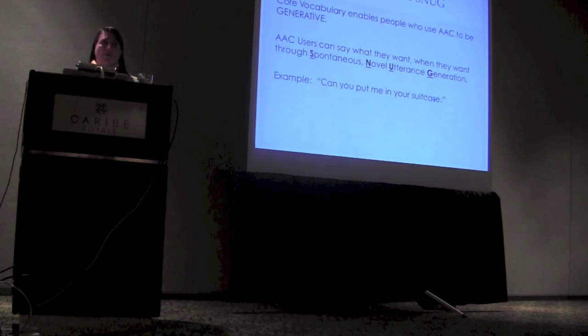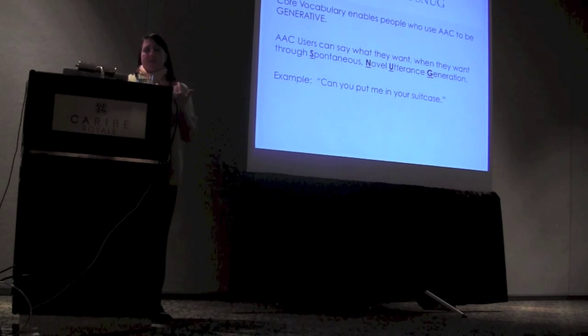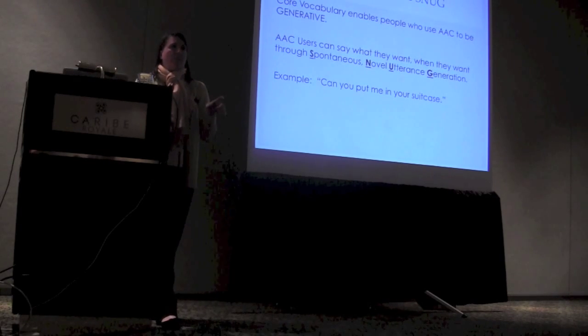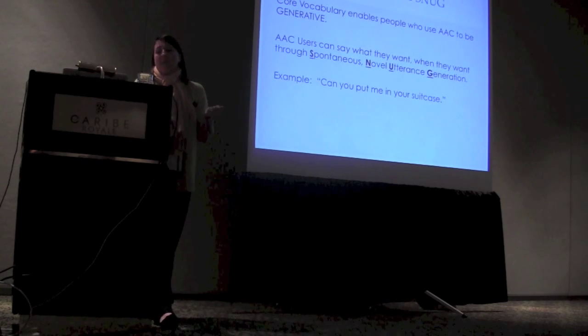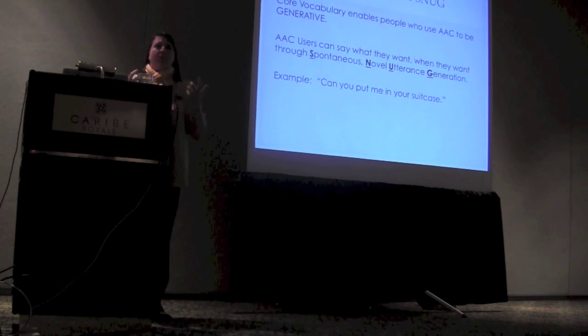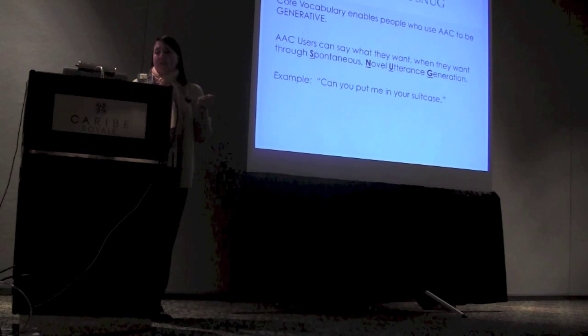And I love this example. Last summer I had the opportunity to participate in the ISAAC AAC camp in Pittsburgh. I was talking to one of the moms whose child was coming to camp, and she was talking about her son. Her son is a highly involved, physically little boy who uses two-switch scanning in Unity 45.